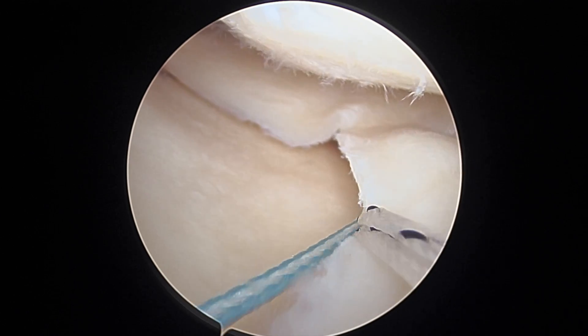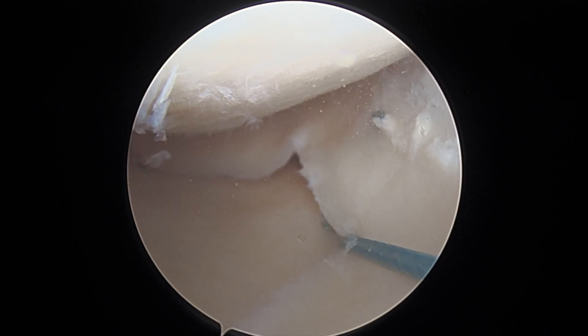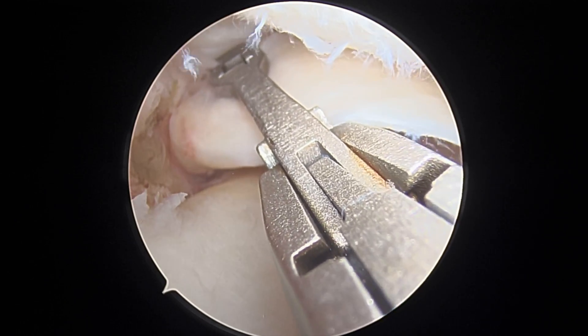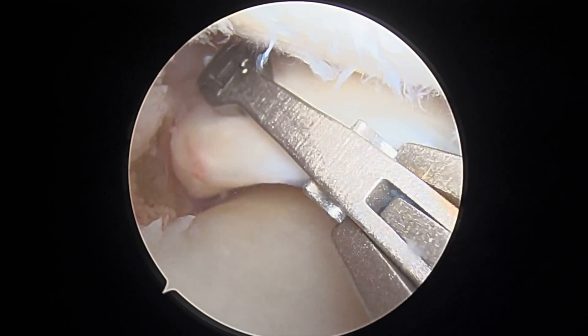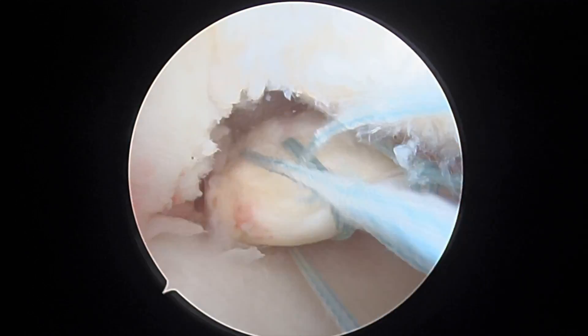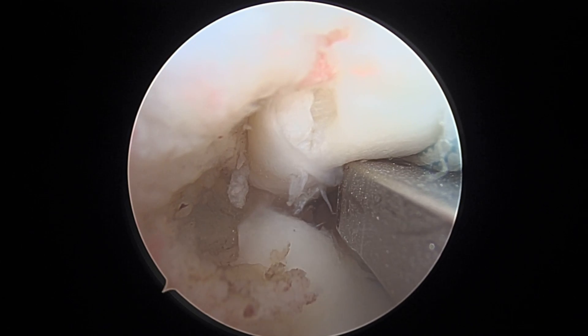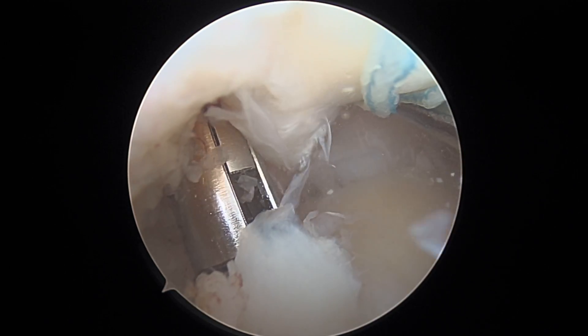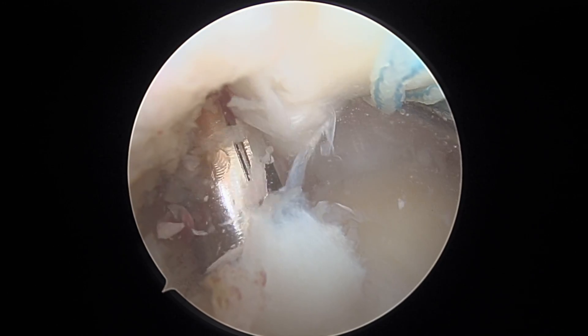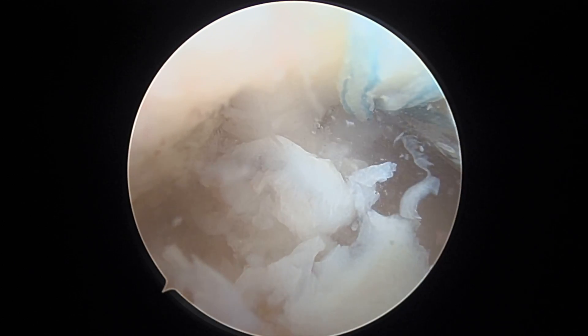After this has been passed, we're then able to shuttle that suture through the locking mechanism, which reduces the meniscus to the plateau. We then proceed with our root repair, placing locking stitches — these are O sutures. We place three of them, passed with a scorpion. We then place the guide for the meniscus root repair. The flip cutter is placed, typically either five or six millimeters, and we drill back for a depth of 15 millimeters.